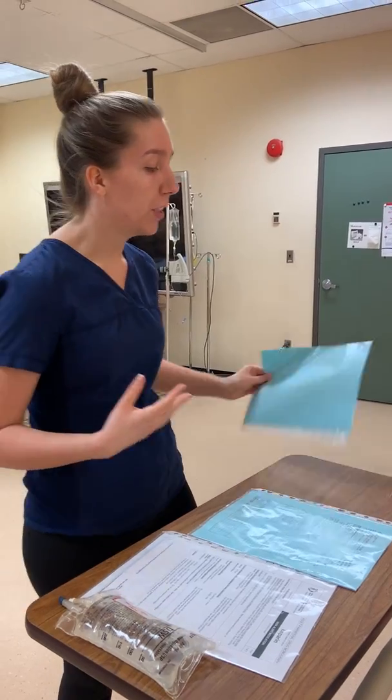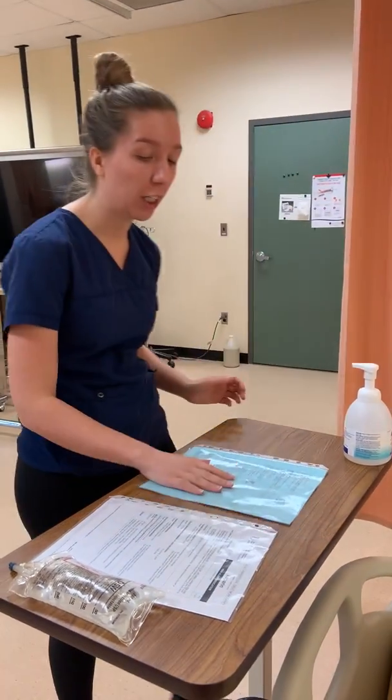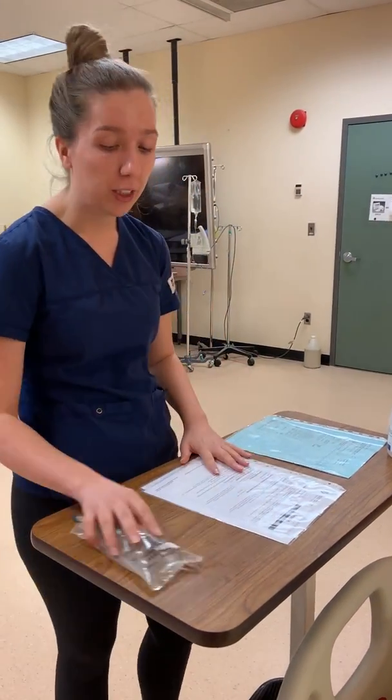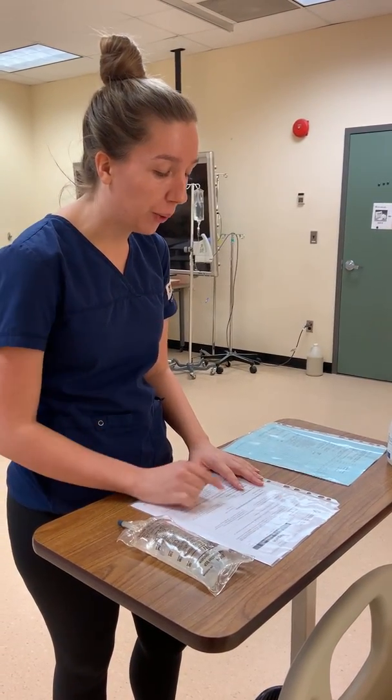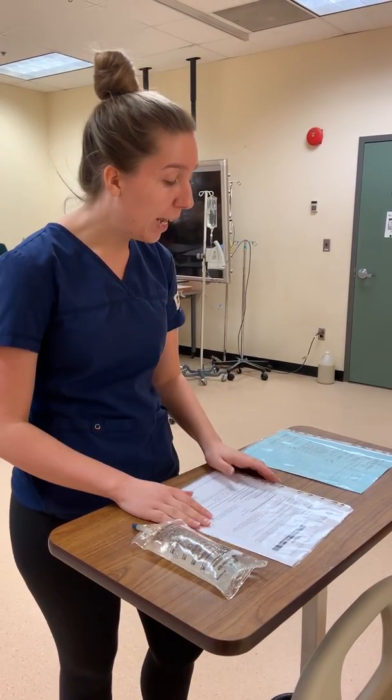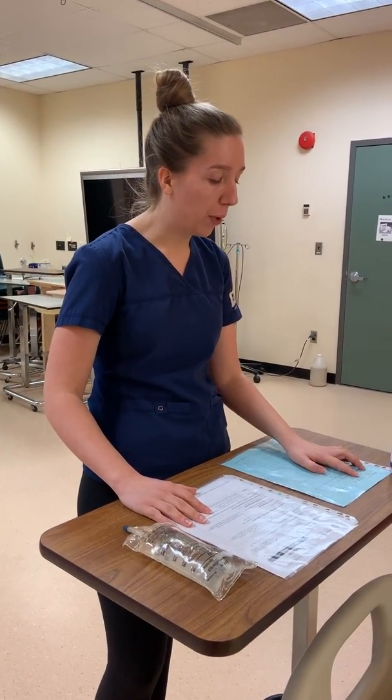So for now, I'm going to put the physician's orders away and complete my first check by looking more into the monograph and with my bag. So again, I have the drug name heparin, which is an anticoagulant. It is a high alert medication, but it may be administered by a student nurse. Now my patient is receiving it for thromboembolism.